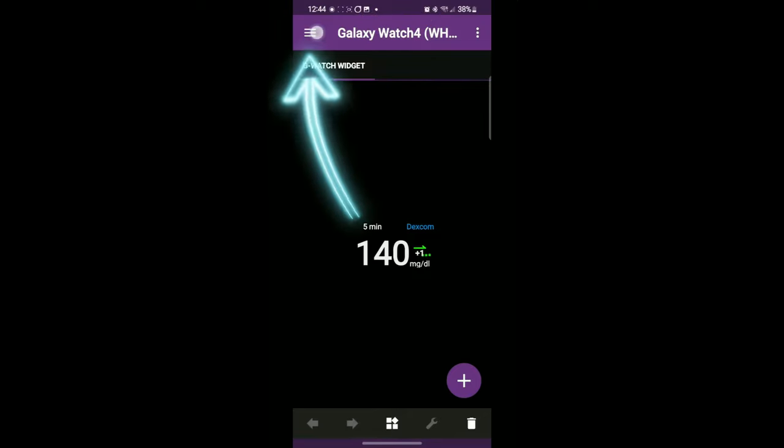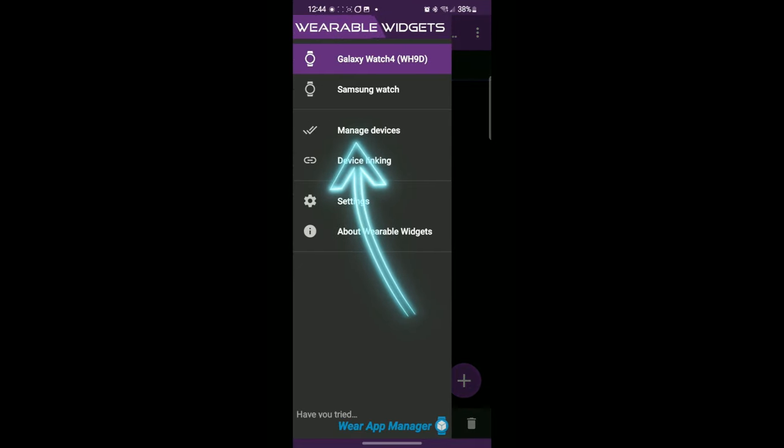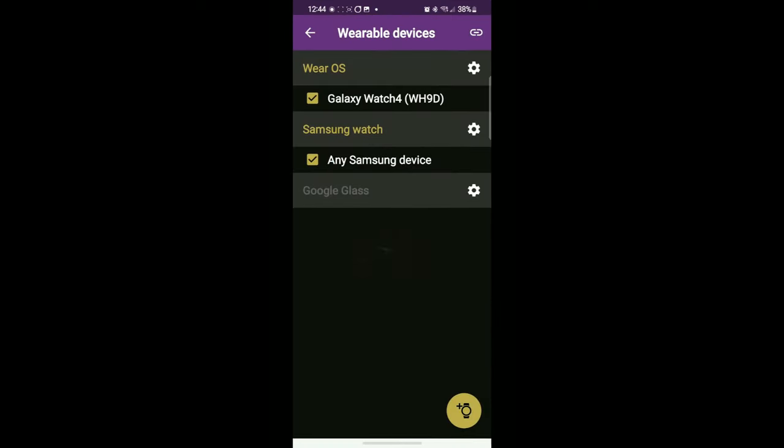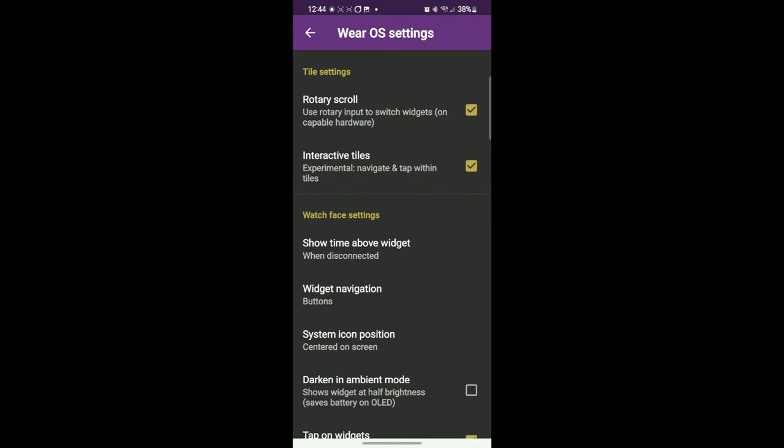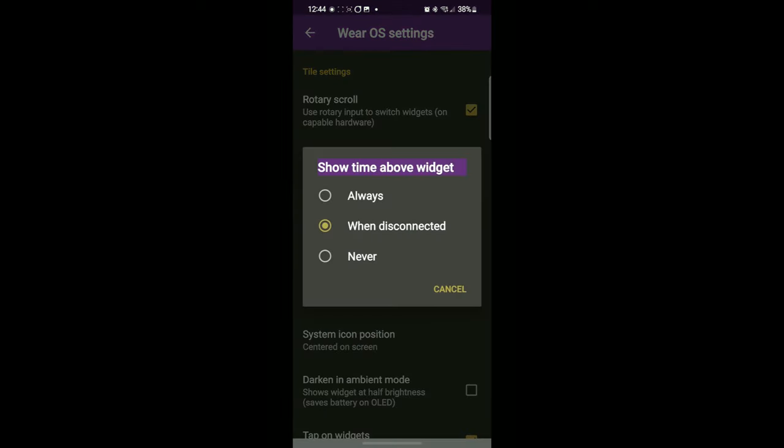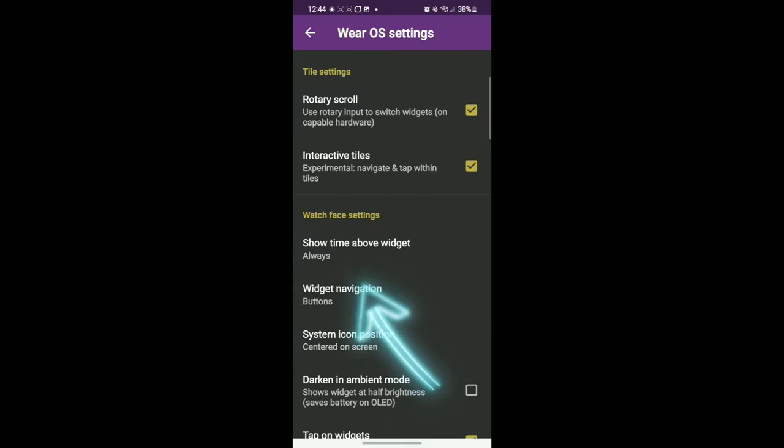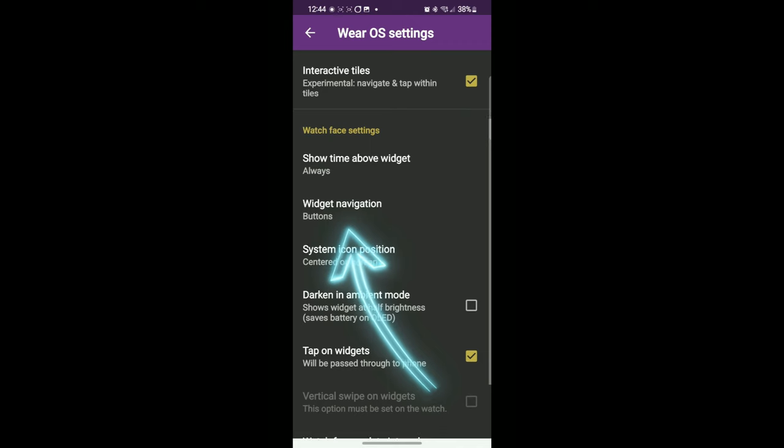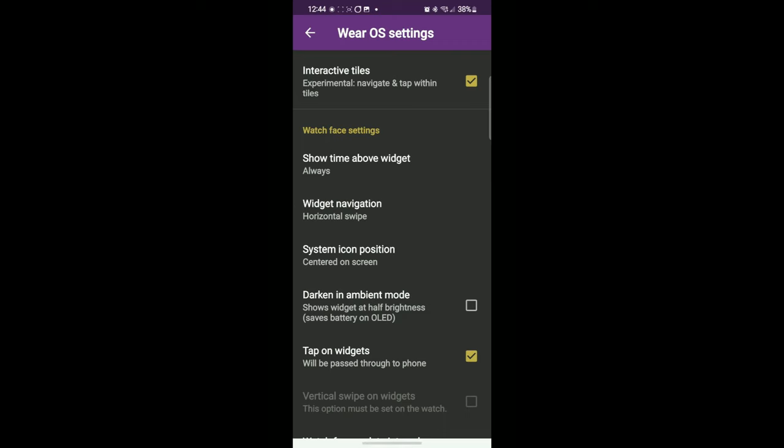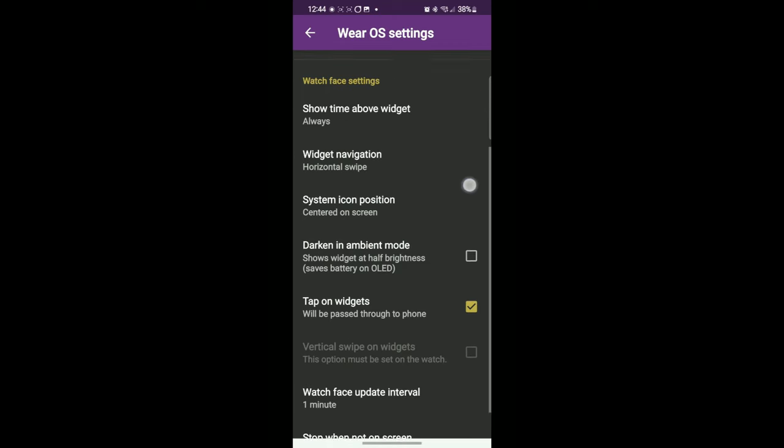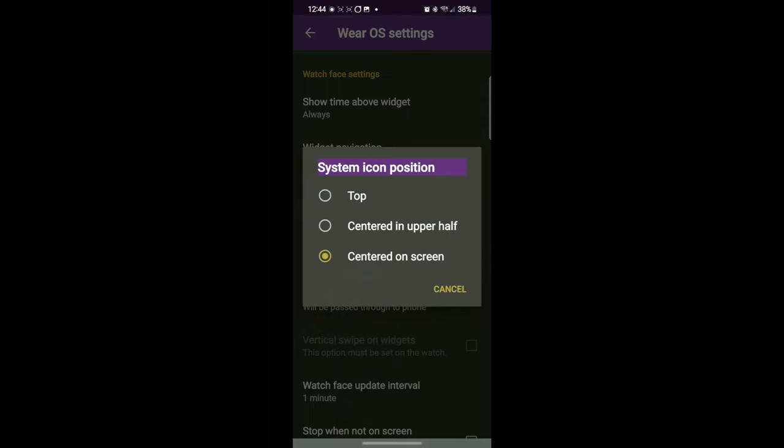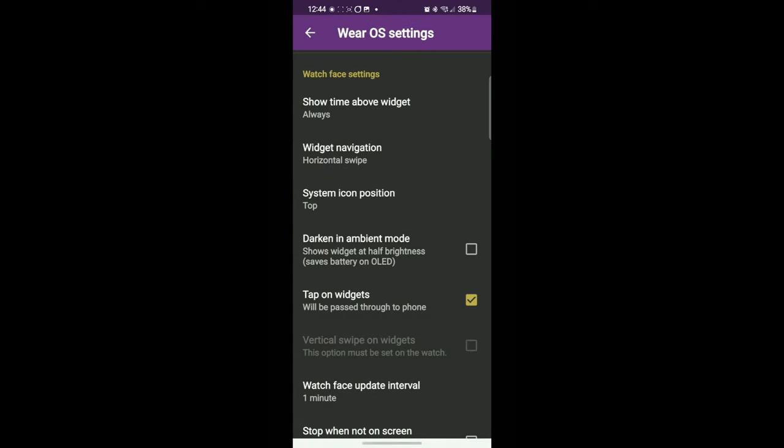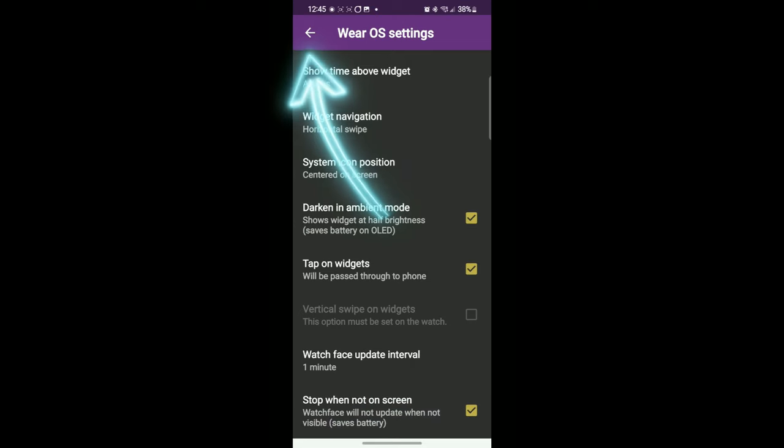So what you need to do now is configure it a little bit further. Go to manage devices. Now you'll see a Wear OS option up there. It wasn't there before even though it didn't even work, it's there. So now what I want to do is hit the rotary scroll. Interactive tiles. Show the time above the widget. I always want to see the time. There it is. And widget navigation horizontal swipe. I like using the swipe, not the buttons. System icon position, centered on screen. You can also do at the top. These are just kind of what's going to work best for you. Darken in ambient mode, that's another save your battery option. And then all the way down to the bottom, stop when not on screen. That's another save the battery option. So we're going back now. Back to refresh and that should update everything. And you're all done.